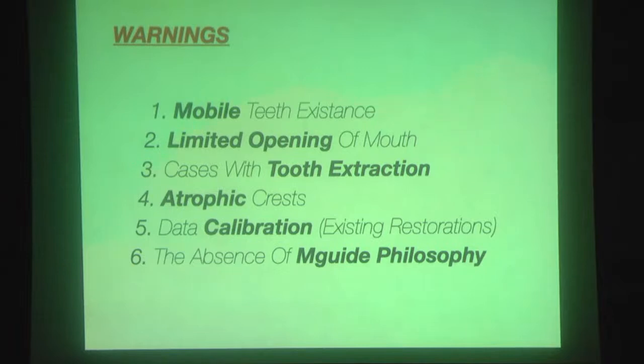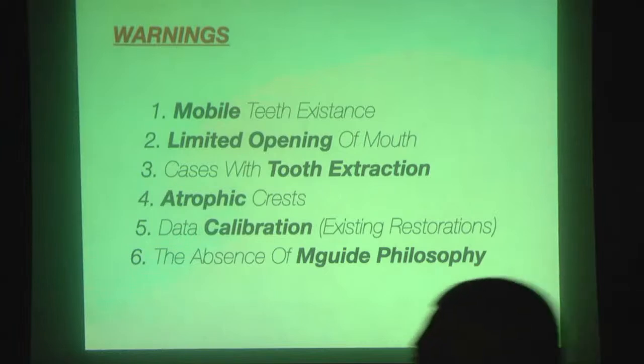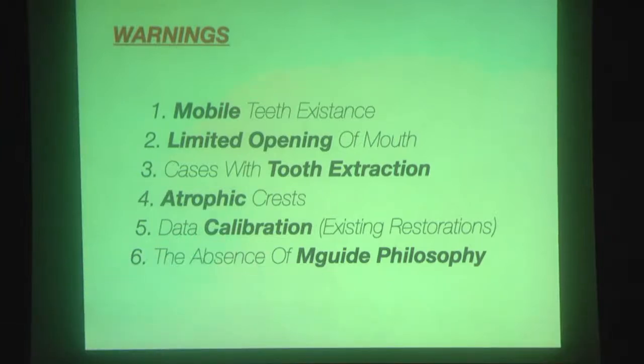Cases with tooth extraction. You know, in the model, we remove the teeth as if we had extracted. But it's not the same. Normally, it's not the same. So you have to be very gentle. And if you haven't done any guide procedures, maybe at least 20 times or 25 times, do not use it. Why? Because it's about estimating something. The M-guide system doesn't like estimations. The system likes precision.